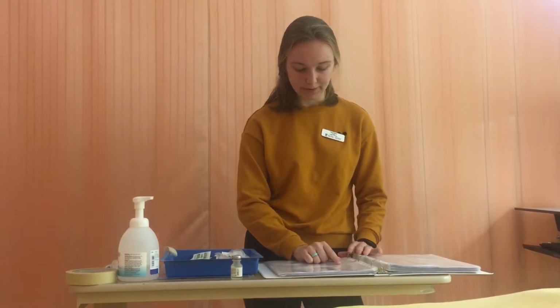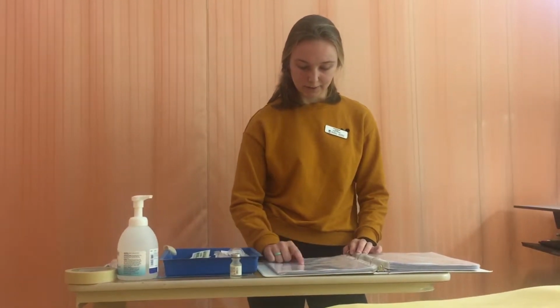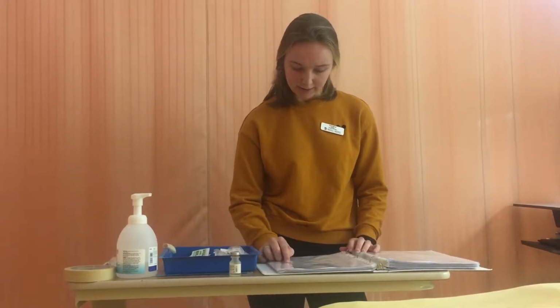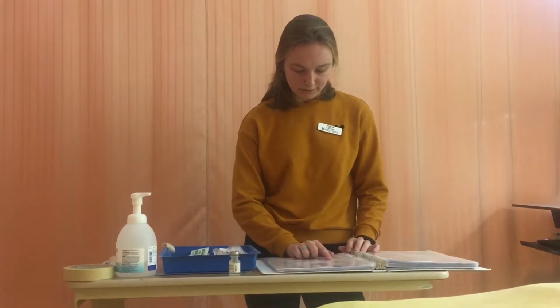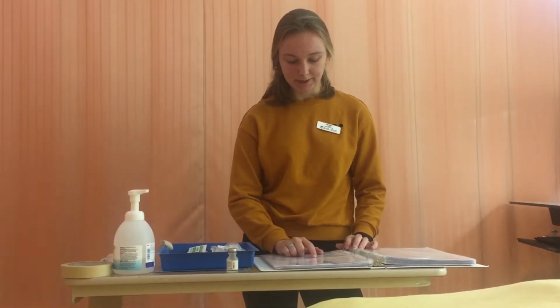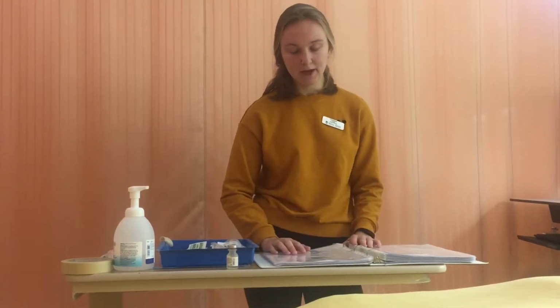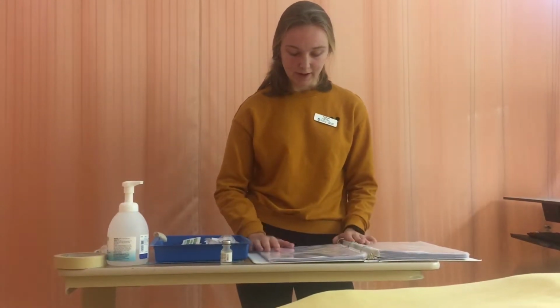So we have a 5 million unit vial, and we're going to be adding 8.2 milliliters of sterile water for a total volume of 10 milliliters and a final concentration of 500,000 units per milliliter. So it can be given IV intermittent. We will dilute it in 100 milliliters of normal saline. It can be within 50 to 100 milliliters, but we're going to be giving 100 milliliters because the patient is a little bit dehydrated, so we just want to make sure that her fluid balance is maintained.